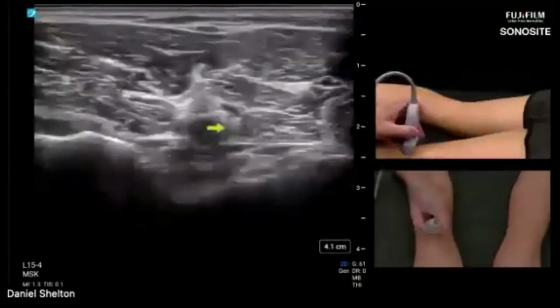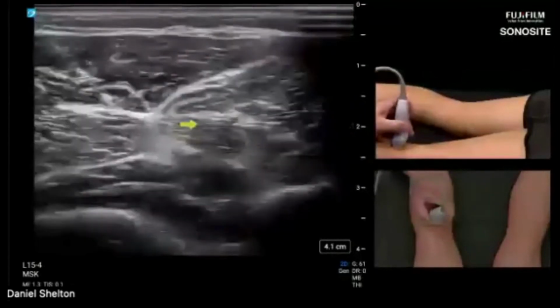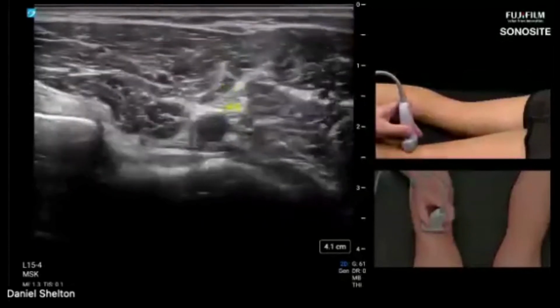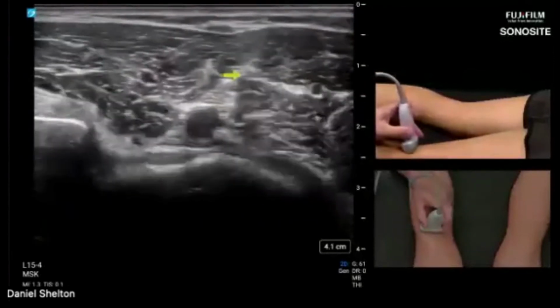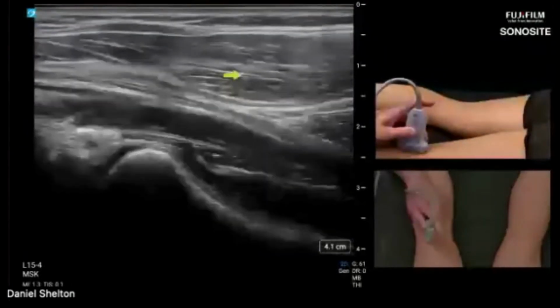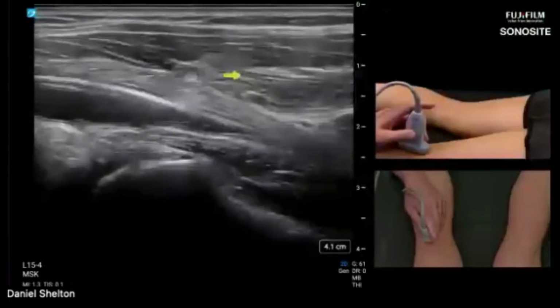We went through that tibial nerve. Here it was. Model definitely doesn't have one. Easy anatomy to scan. I'm going to go long axis on this nerve. It's right under that medial head gastroc. So I'm just going to spin the transducer. Long axis there. And that's the same level of that last slide.